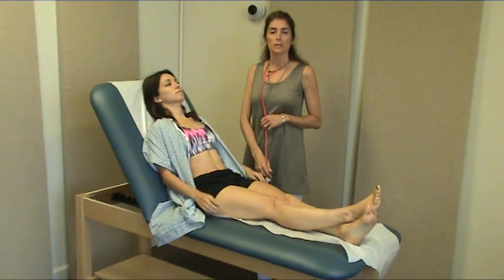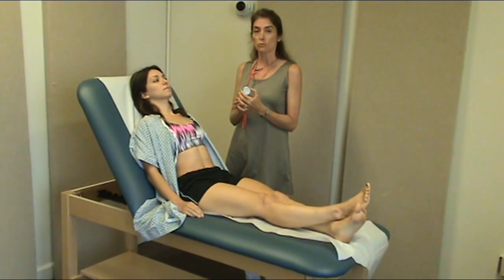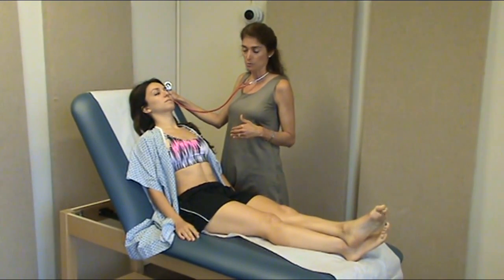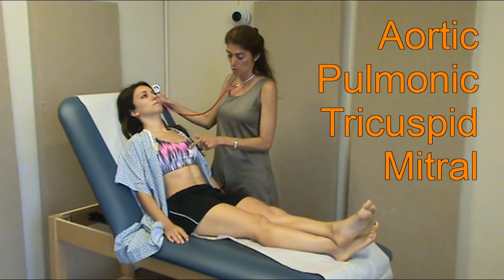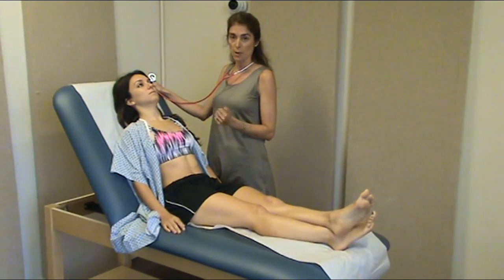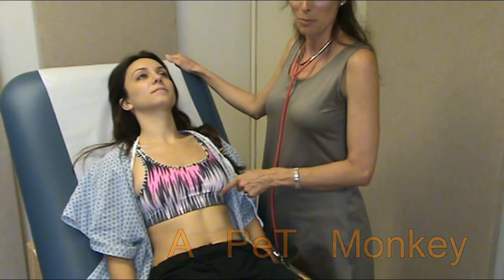The next step is auscultation, and you're going to use the diaphragm of the stethoscope, so the flat part of the stethoscope, to listen for normal heart sounds. So in auscultating, you're going to auscultate at each heart valve: the aortic, pulmonic, tricuspid, and mitral. A mnemonic to remember these valves is A, pet, monkey. A is for the aortic, P is pulmonic, T is tricuspid, and M is mitral.